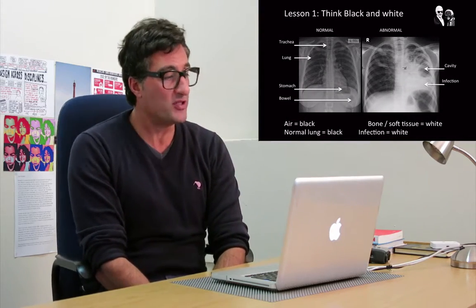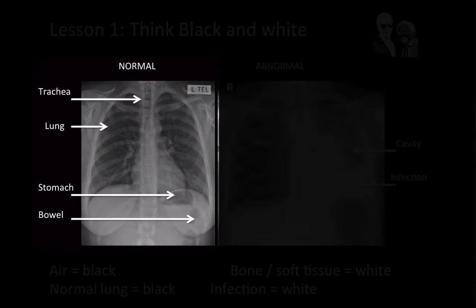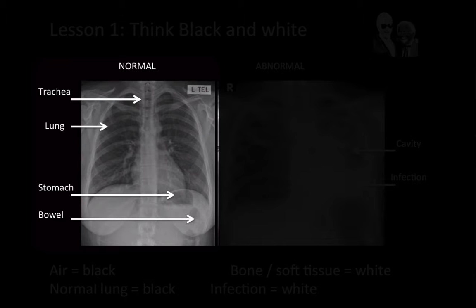I've put on the left a normal chest x-ray — this is an adult — and you can see the areas I've pointed out: the trachea, which contains air, the lung, the stomach and bowel below the diaphragm, all contain air and are therefore black. So keep in mind that a normal healthy lung should be full of air and should be black, because the x-ray is usually taken with the patient having inspired.